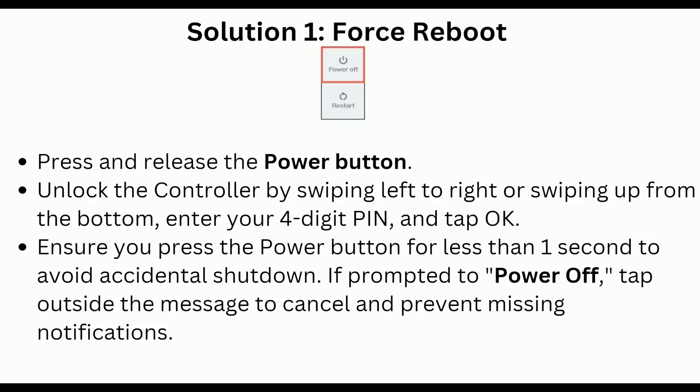Solution 1 is force reboot. Press and release the power button, then unlock the controller by swiping left to right or swiping up from the bottom, and enter your four-digit PIN and tap OK. Ensure you press the power button for less than one second to avoid accidental shutdown. If prompted to power off, tap outside the message to cancel and prevent missing notifications.